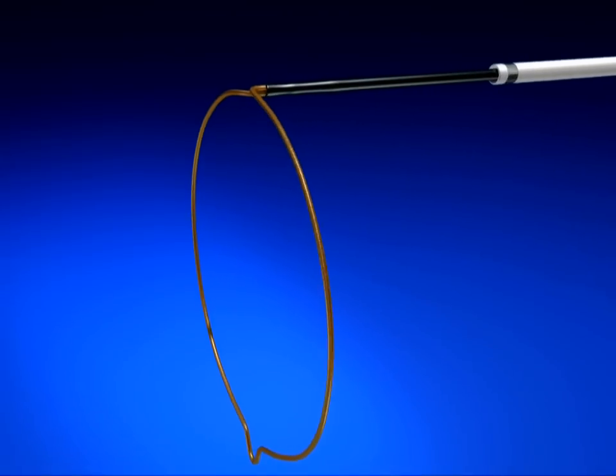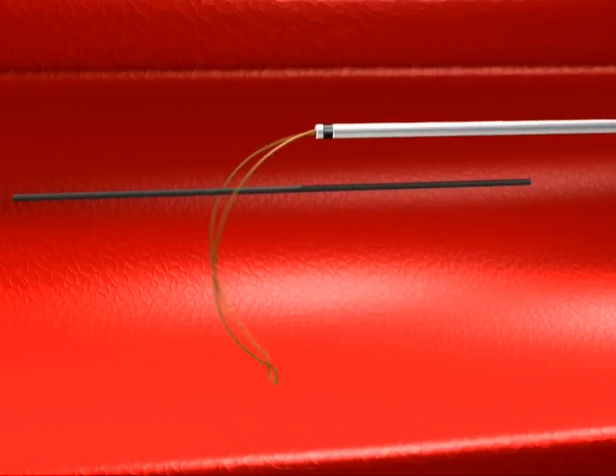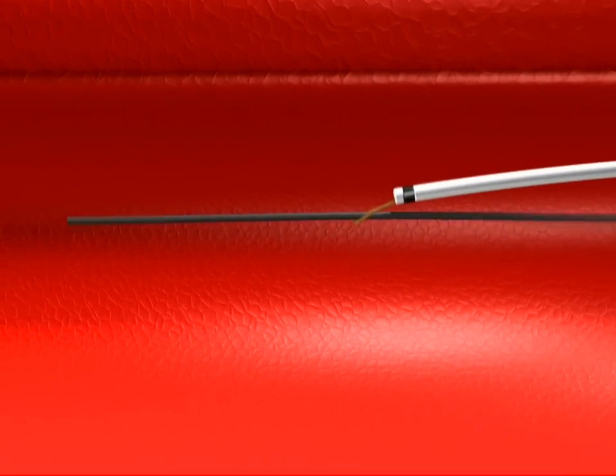Merit Medical is pleased to provide the One Snare Endovascular Snare System, designed to promote both accuracy and reliability for effective foreign body manipulation and retrieval.